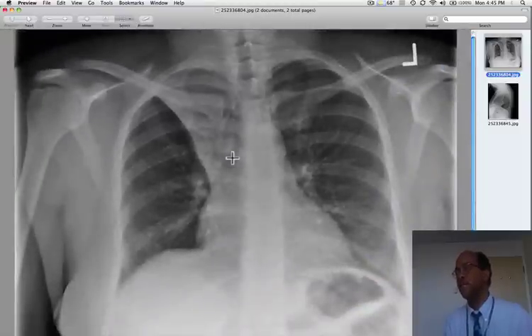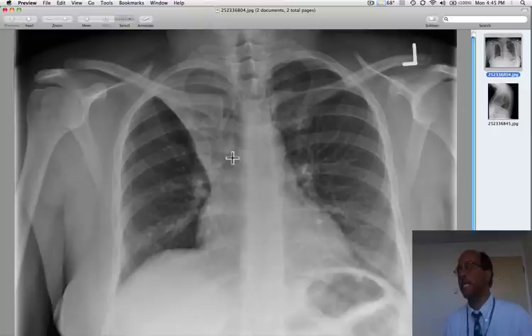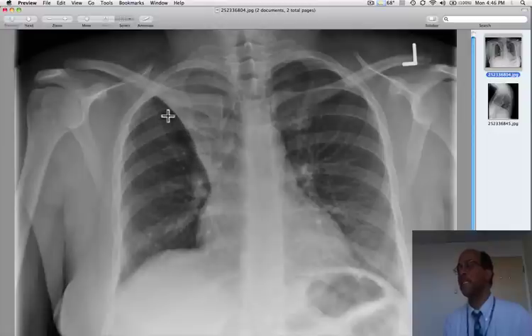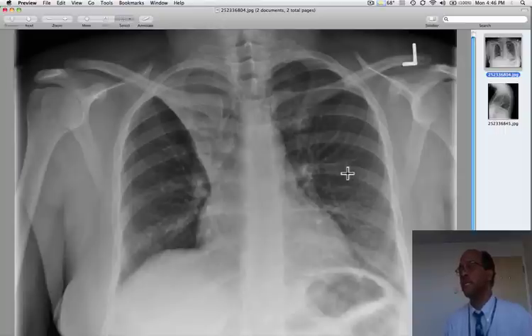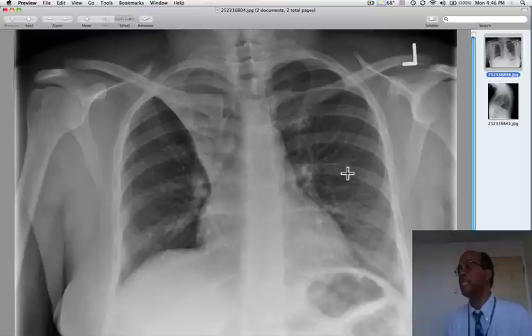It's a lot easier to see right upper lobe collapse than left upper lobe collapse. The horizontal nature of the minor fissure means that when it collapses, the x-ray remains tangential to the plane of the fissure. Whereas on the left, the left upper lobe is displaced anteriorly and simply creates a veil-like opacity. Let's look at the lateral projection.